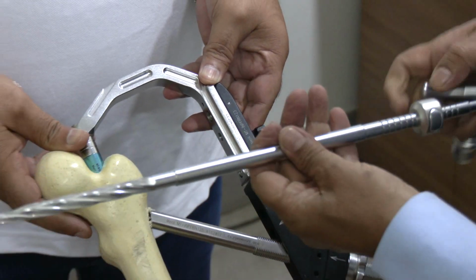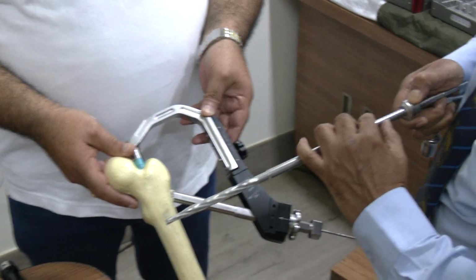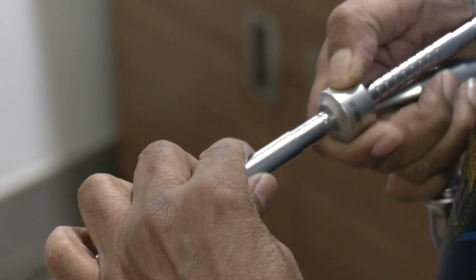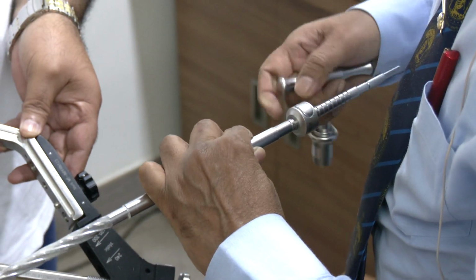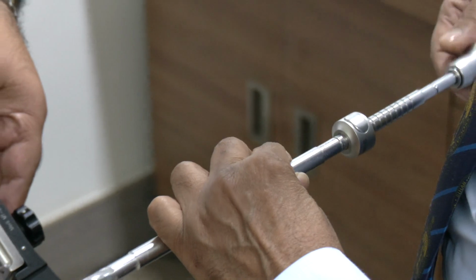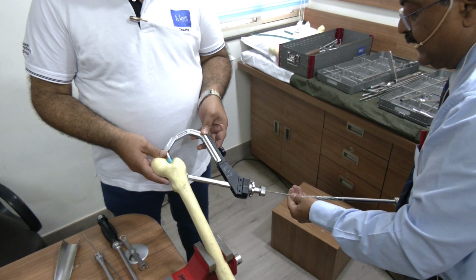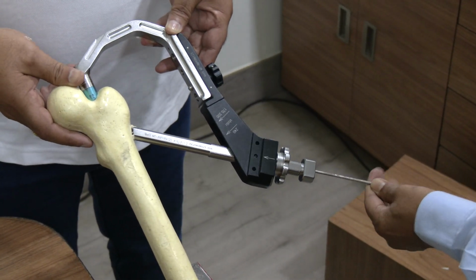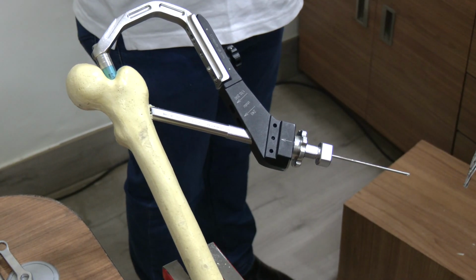Since we are using an 80 millimeter blade, we keep this at 80 millimeter. It gets locked, and in osteoporotic bone you can remove it with the hand only, but in this case, let me see. Again, this instrument also has bone inside.